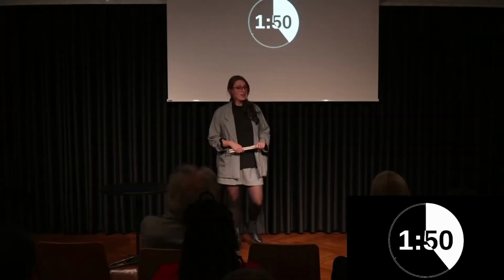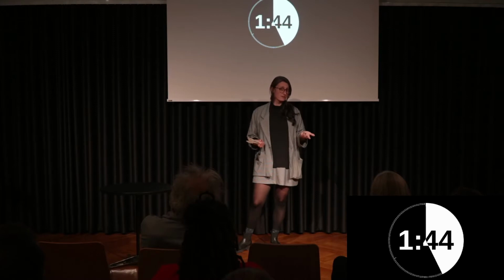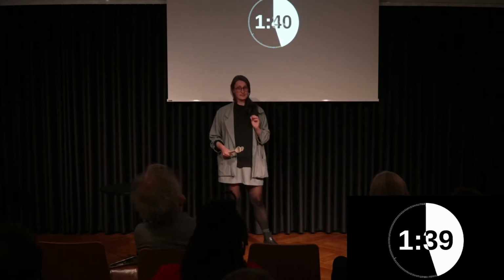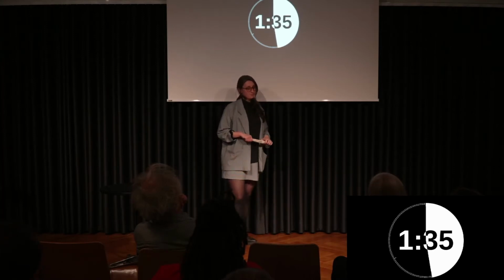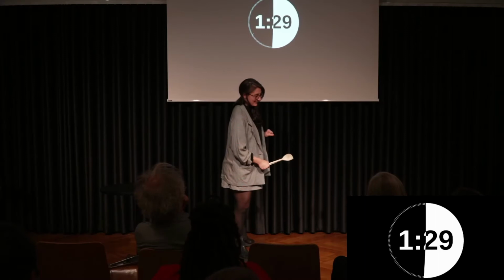Magnetic. The MRI uses the fact that hydrogen is very common in the human body because we're made up about 70% of water. The hydrogen's nucleus is one single proton that is spinning around its own axis like the Earth's rotation. And just like the Earth, the proton has a north and a south pole, so it's like a tiny magnet.